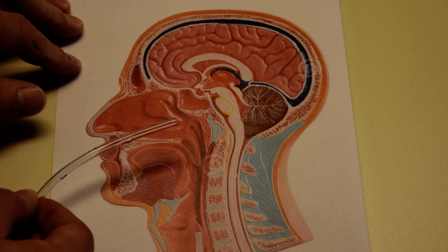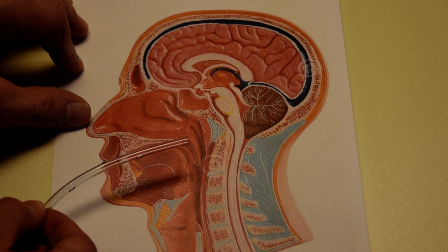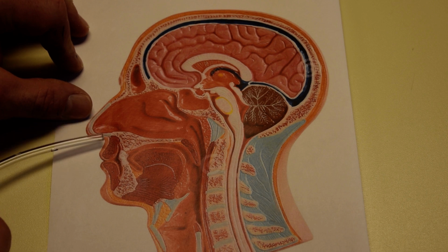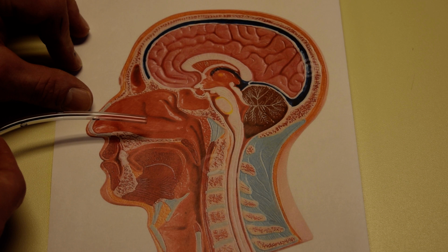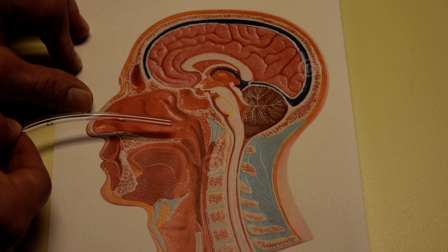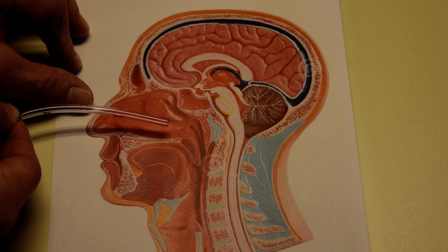So one of the biggest tips that you can provide is you grab the tip of the nose and you push it upwards so that the nares are now facing you directly. This allows you to go in at a 90-degree angle to the face, and even sometimes if you can achieve a downward trajectory, that is ideal.